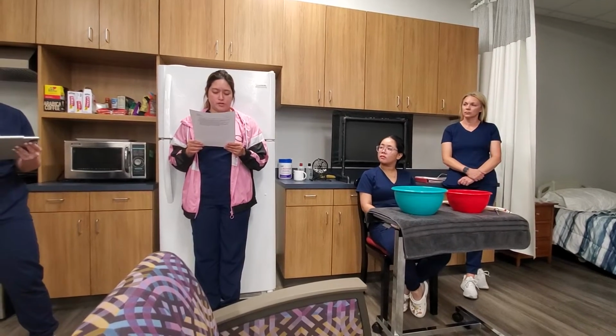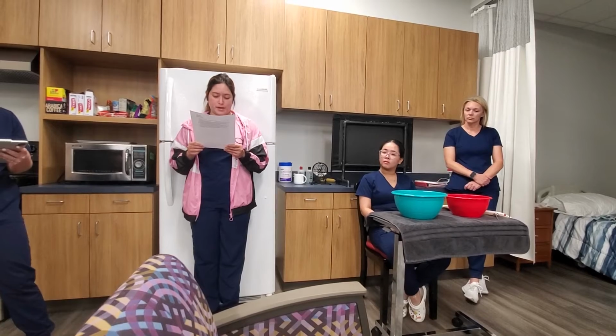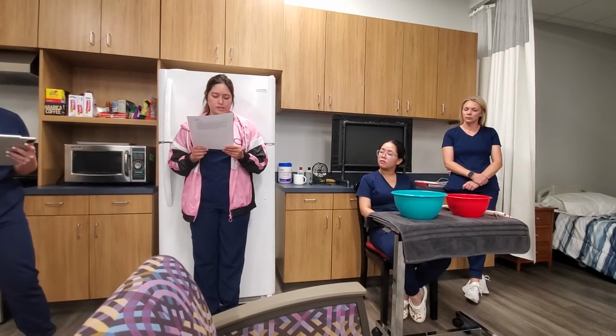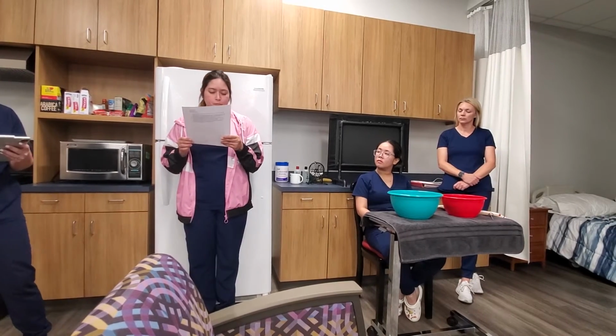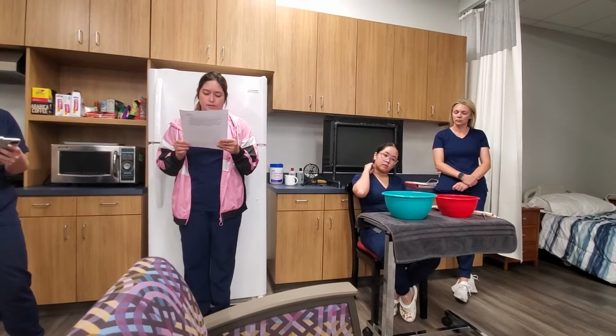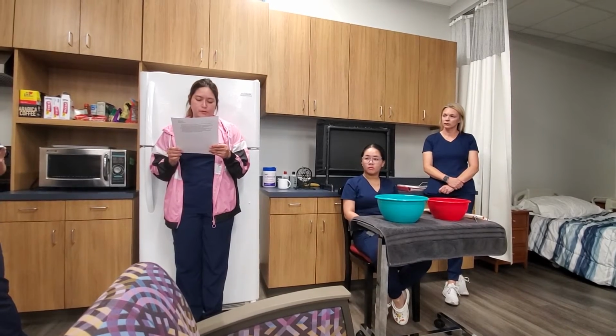Some contraindications are open wounds, sutures, pins, or staples in place, infections, poor skin conditions, and any question of skin integrity. Using contrast baths with these conditions may decrease healing times and increase skin, joint, and wound irritation.